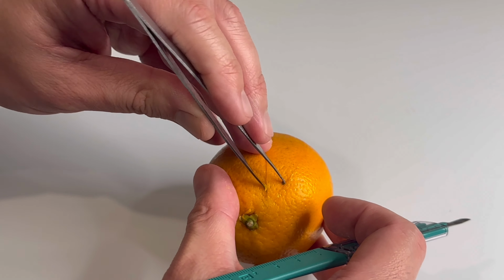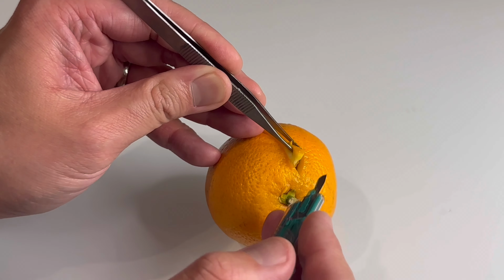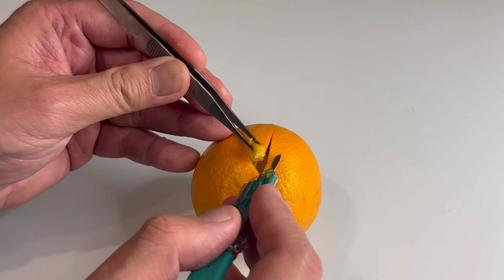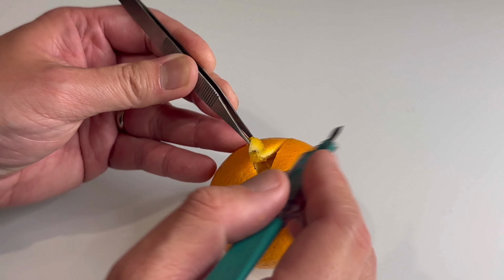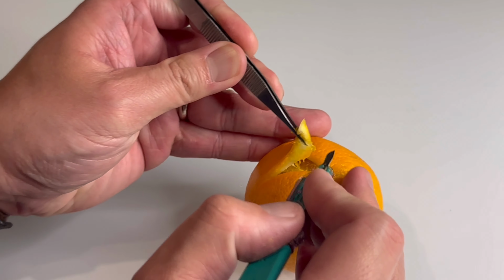So if we're peeling this orange up, we're going to show you planes of dissection. So you have to retract and be able to expose so that you could see the attachments. And when you see the attachments, you could gently sweep it. We're going to retract further, right up here.